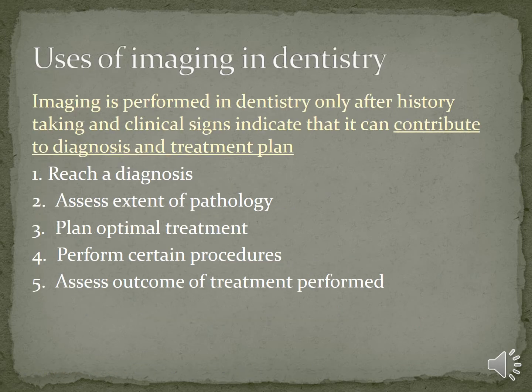The uses of imaging, that means we're talking about X-rays as well as other forms of imaging in dentistry. Imaging is performed in dentistry primarily only after history taking and clinical signs indicate that it can contribute to diagnosis and treatment plan.